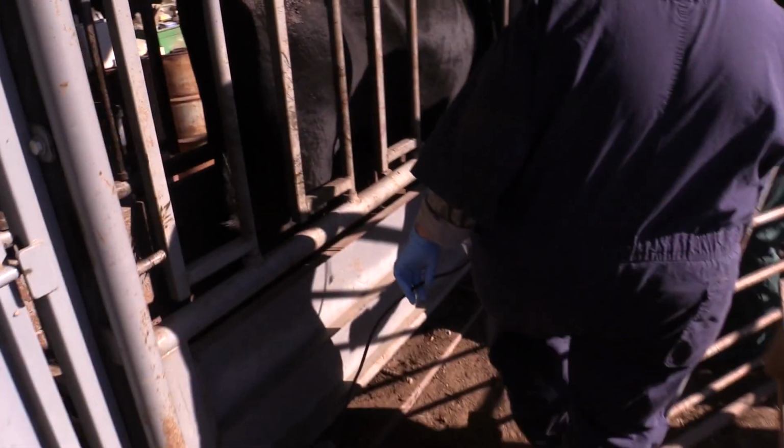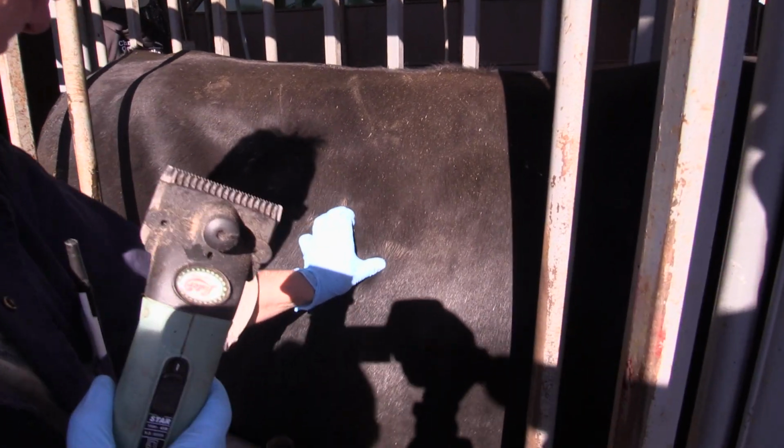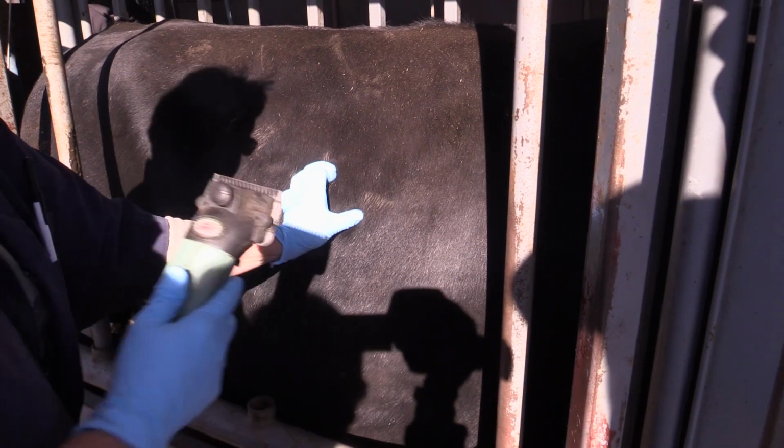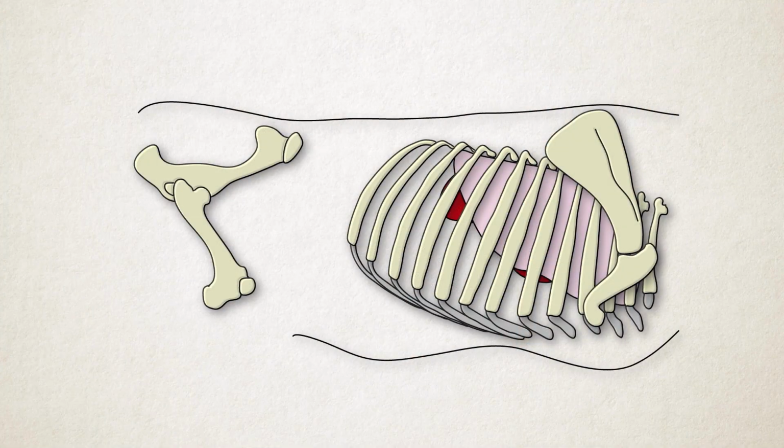To begin, restrain cattle as needed. Do not squeeze the animal in the chute, as this will change the location of the liver. If the animal is fractious, move on to the next one.